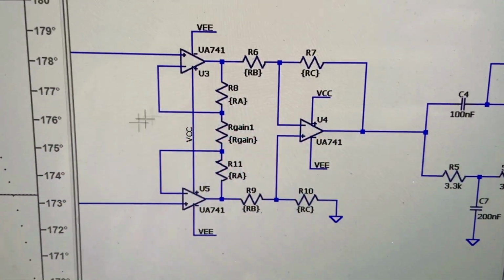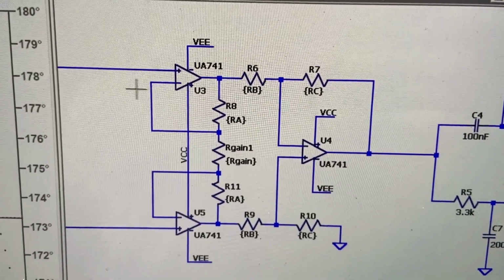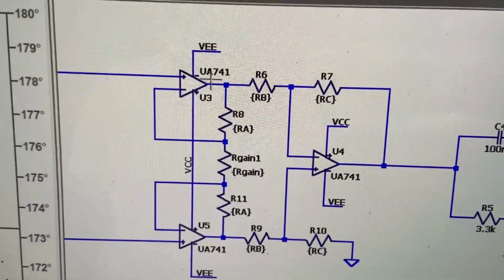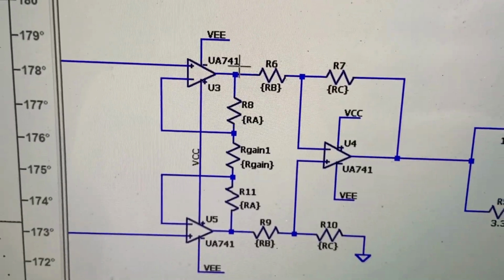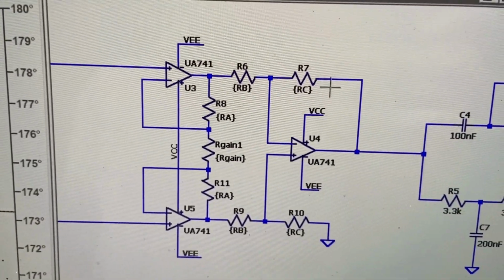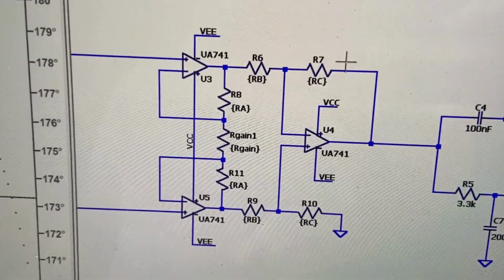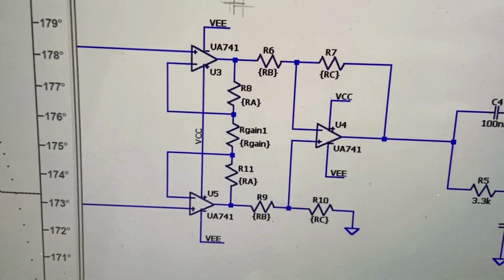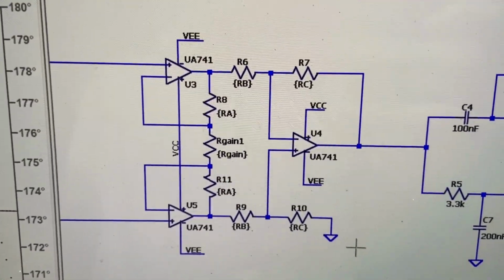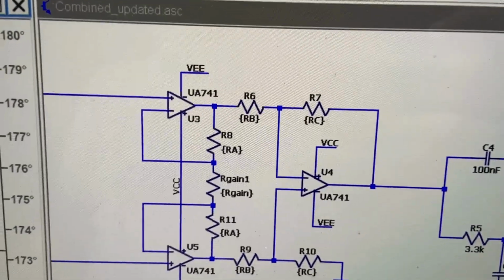Alright, so this is our instrumentation amplifier part of the circuit. It essentially consists of 3 op amps, which are the UA741, right? It further consists of resistors. The resistors in turn provide the configurations that we require to obtain the particular gain and the particular phase difference. The instrumentation amplifier in total has a gain of 1000, but in our real-life simulations, we obtain it closer to 800 to 850.